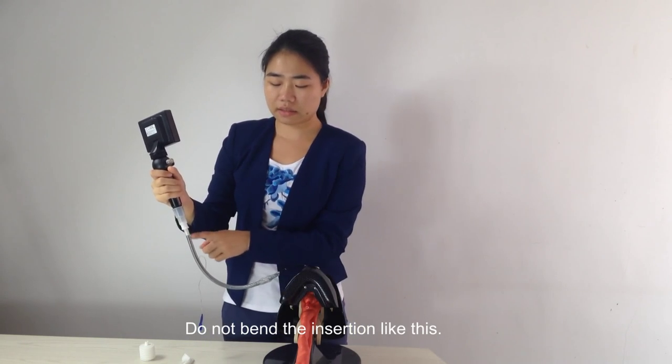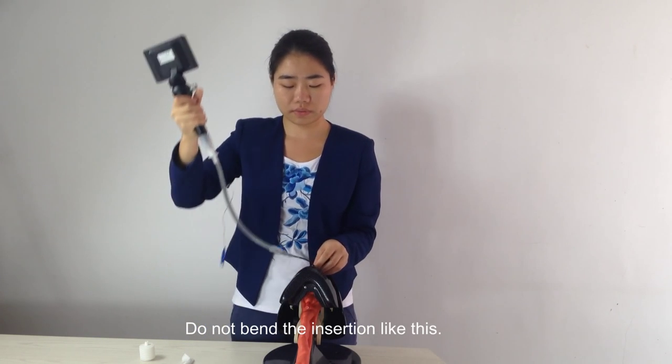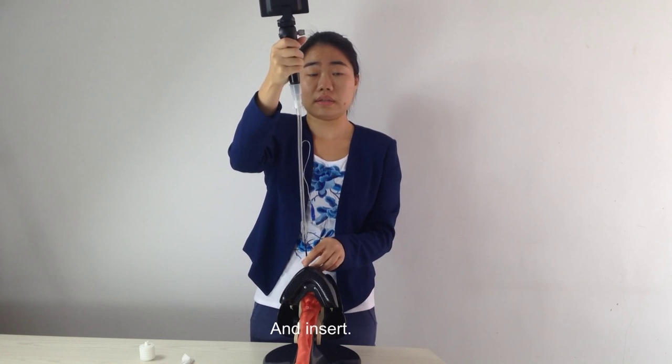Do not bend the insertion tube like this. Then insert.